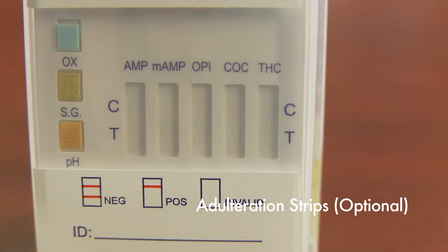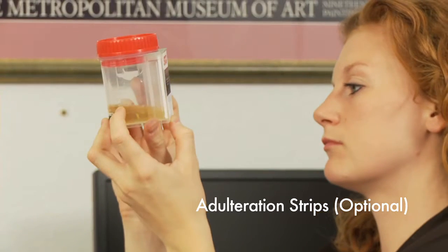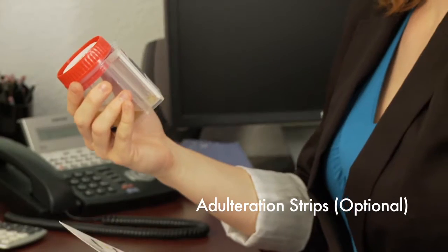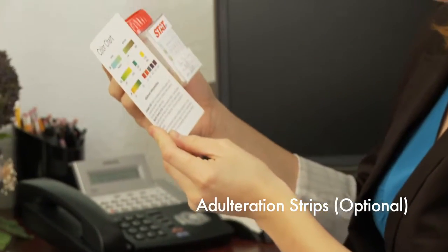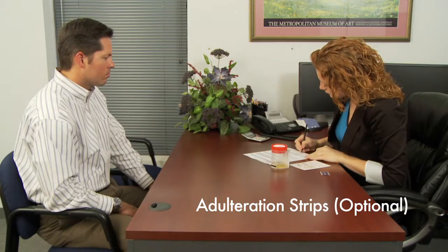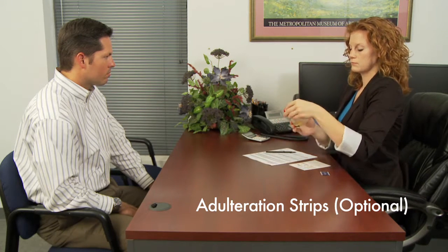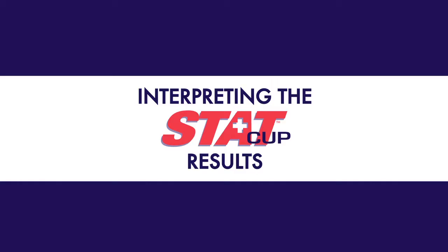The optional adulteration strips offered with the StatCup should be used immediately and then interpreted within 3 to 5 minutes of the test administrator receiving the specimen. Refer to the enclosed color chart to interpret the specimen accurately. Compare colors to determine if the specimen is valid. Proceed with testing if the specimen is normal. Stop testing if the specimen is interpreted as invalid.